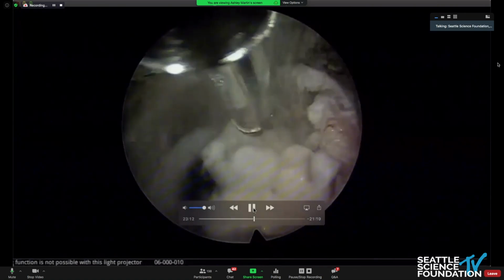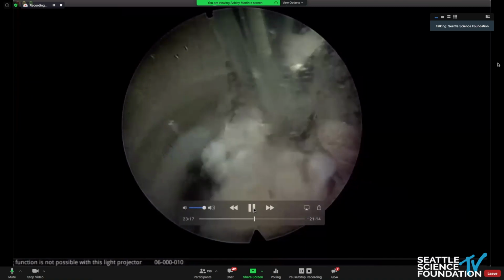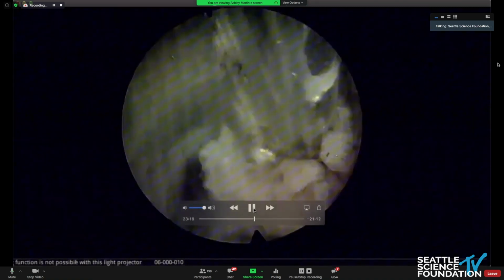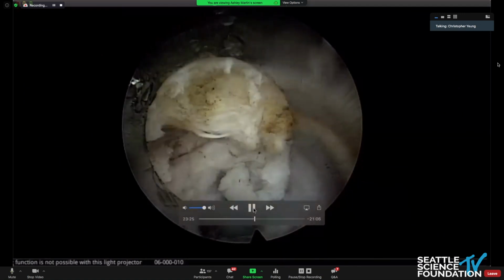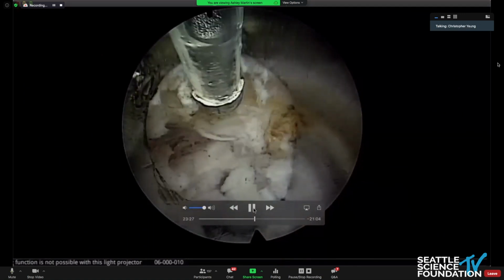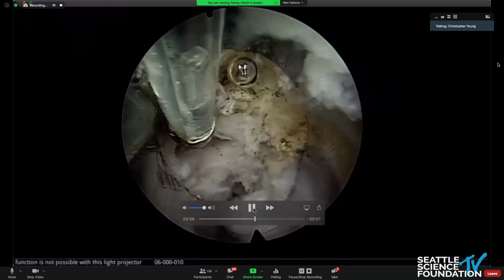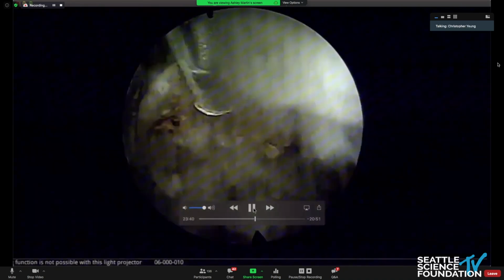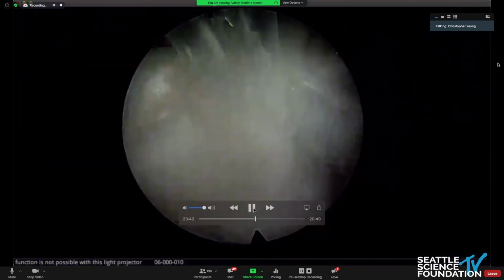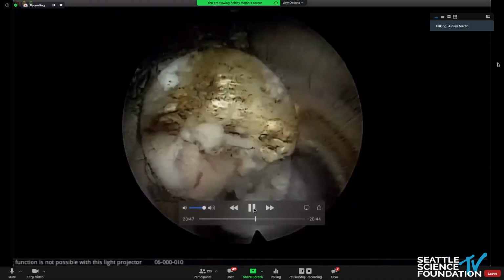There's a question from the audience asking whether the intradiscal dye injection helps in extruded or free fragment identification. It does. Sometimes you get this patriotic fragment, because you get out a fragment that's red, white, and blue. The blue stained portion is the part that was inside the nucleus. The white stained portion is the one that was trapped in the annulus, and the red stained one is the part that was extruded and vascular. So right there it can help.